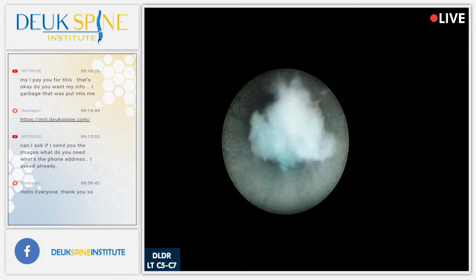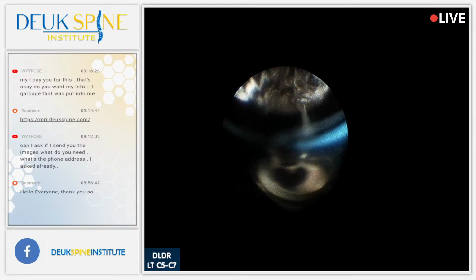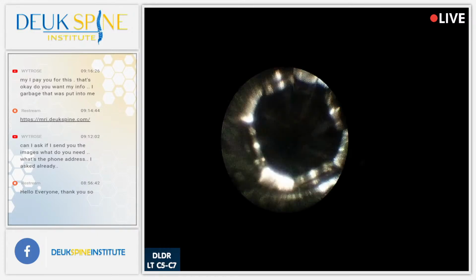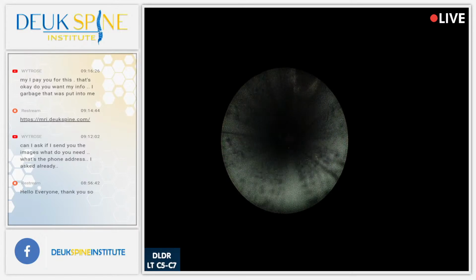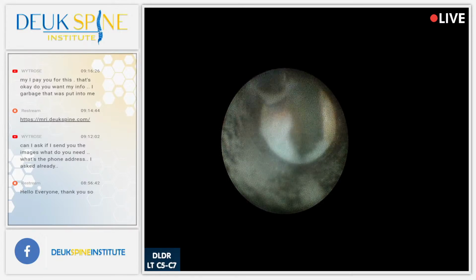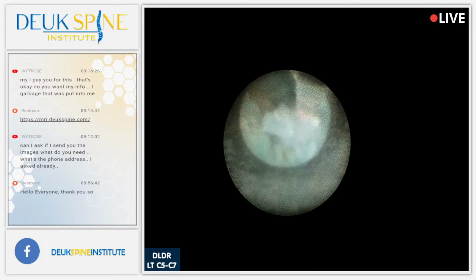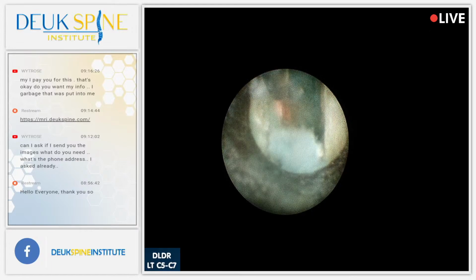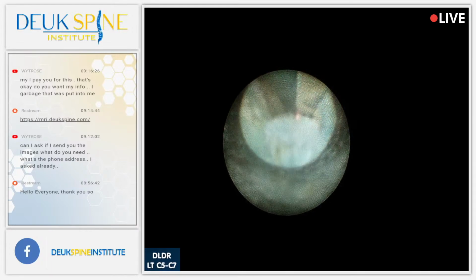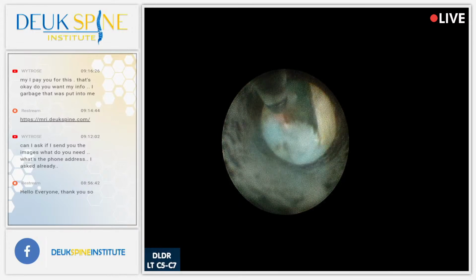So think about how small this incision really is, or how small the tube really is. It's literally the tube that you're seeing right here, side to side, is about 2.8 millimeters. Okay? 2.8 millimeters, not even 3 millimeters. That's about 2.8 laser fibers, almost 3 laser fibers across. That's how small this is.